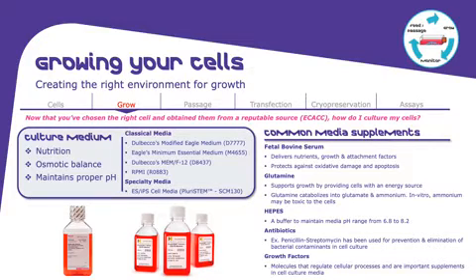You can easily go on any repository or even our website and see what type of media is needed specifically for your cell type, and also which other supplements need to be added to the cells so they can grow as happy as possible. Please order all your cells and media and reagents before you start your cells, so everything is ready for you. FBS is also very important.